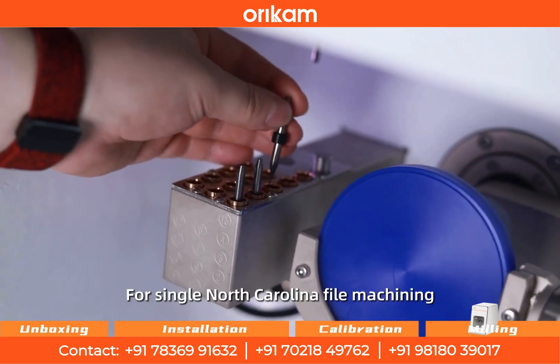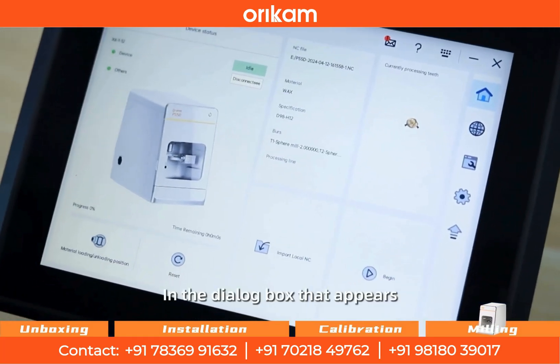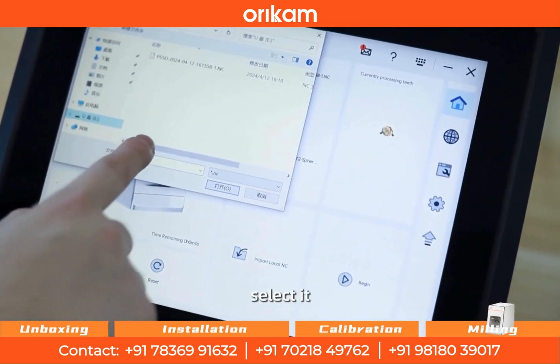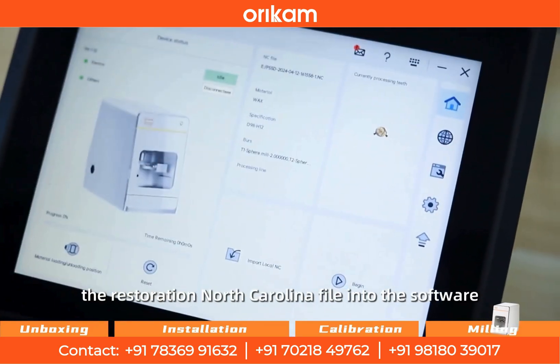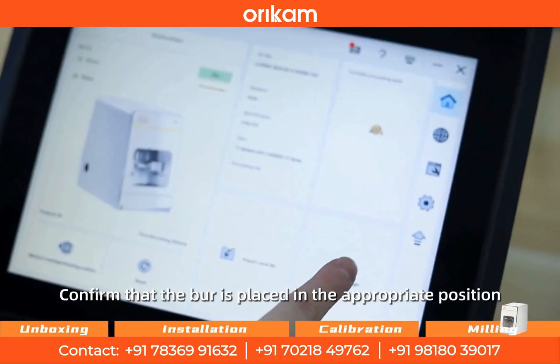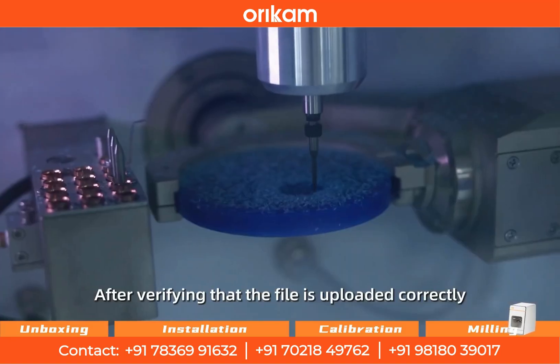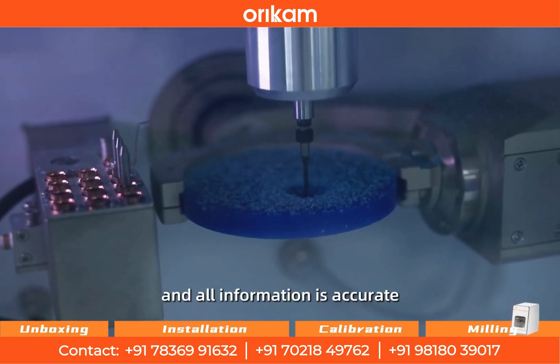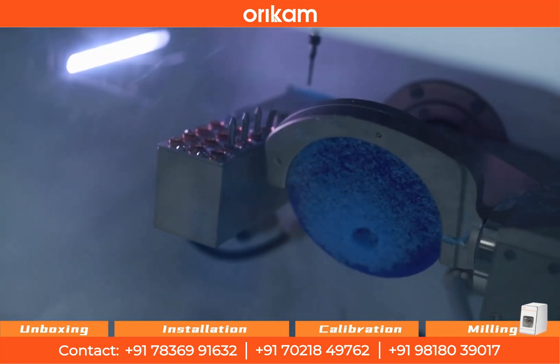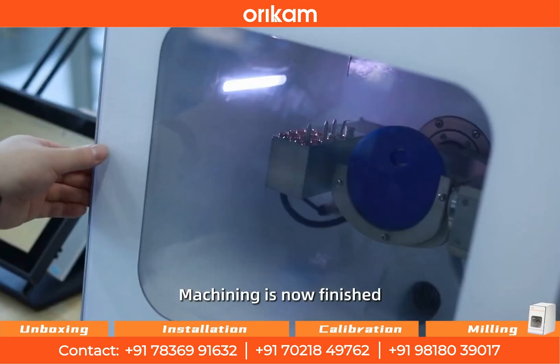For single NC file machining, click the import button on the software interface. In the dialog box that appears, find the path to the pre-processing file, select it, and click the open button to load the restoration NC file into the software. Confirm that the burr is placed in the appropriate position and that the material is installed. After verifying that the file is uploaded correctly and all information is accurate, click start. Wait for machining to complete. Machining is now finished.